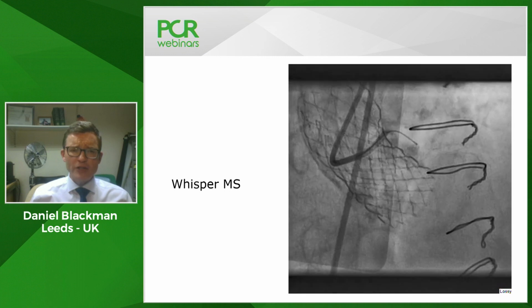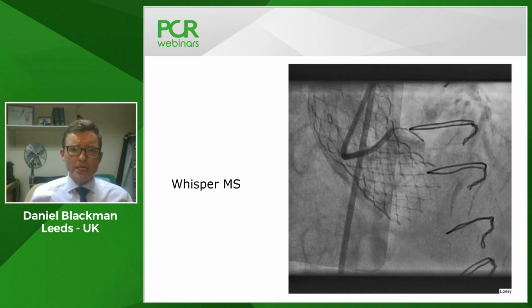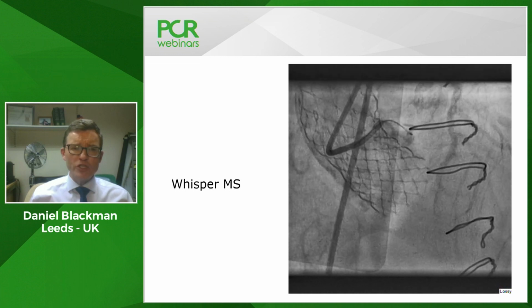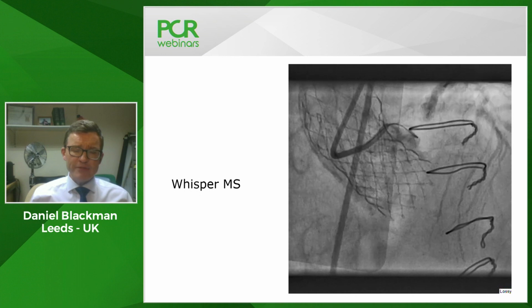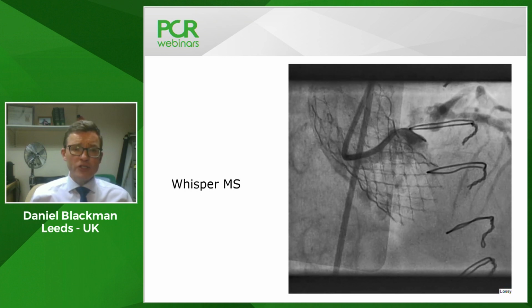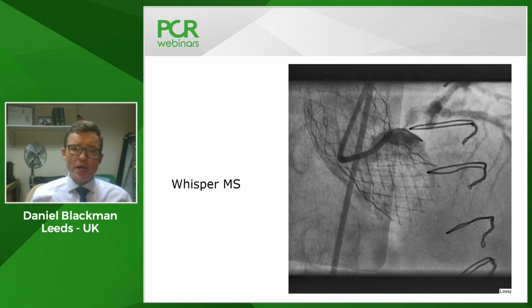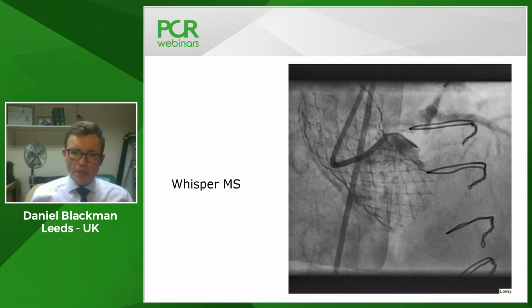If you can't get the guide catheter extension through, the technique would be to follow the wire up instead with a small balloon. Use that balloon, inflate it if necessary in the coronary artery to provide greater anchoring, and that will allow you to have more anchoring to follow up with the guide catheter extension.